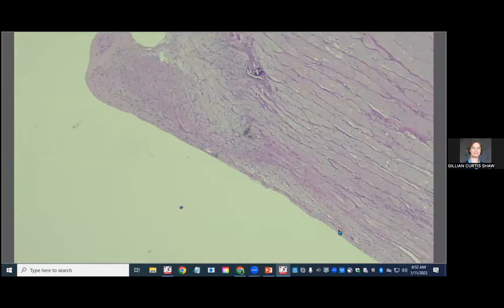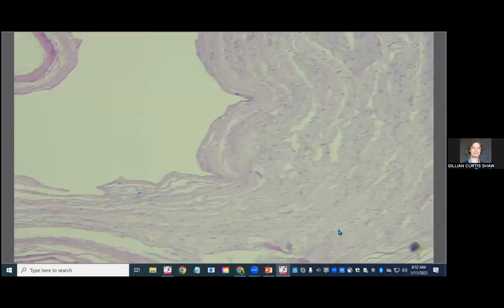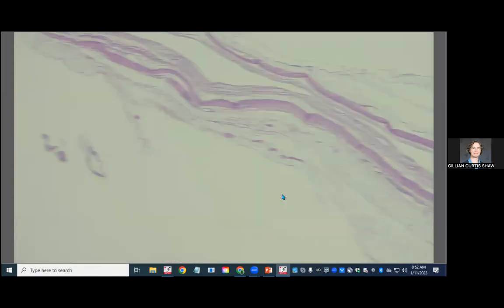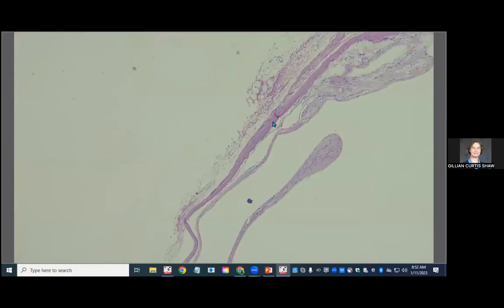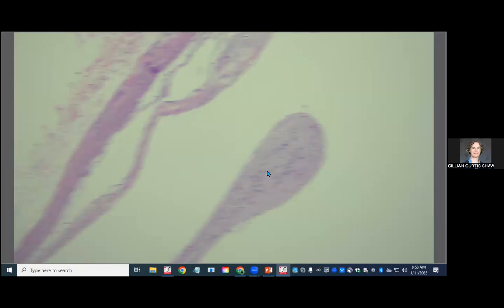And then we follow that back, and then it sort of leads into, so here's some of that scleral tunic. And we actually incised this globe to get it to fit in the cassette better. So it's all a little bit confusing in here. Let's go back over here. So here's more of that collagenous tunic. So a very thin sclera. And then here is some sort of neural-like tissue that's either retina or optic nerve. I'm not sure which it is, but it's quite atrophied.